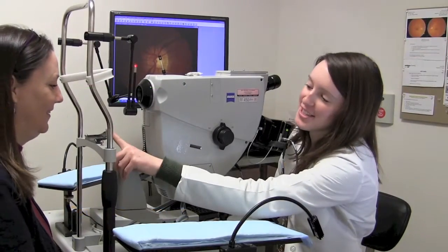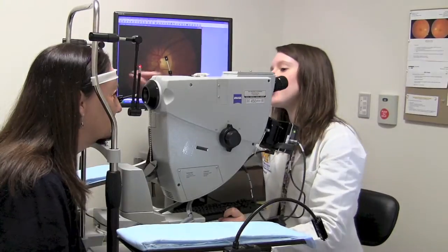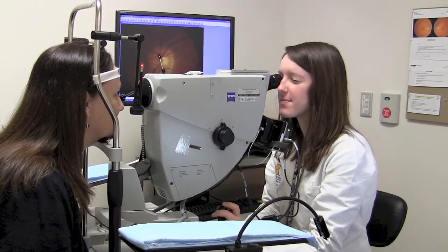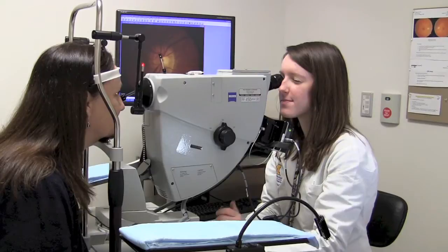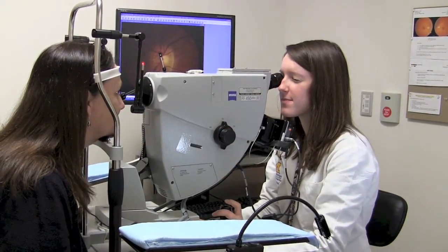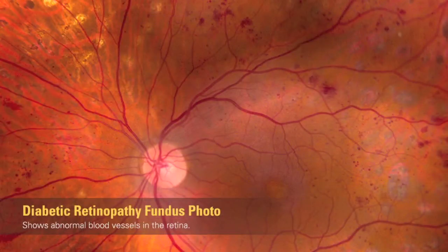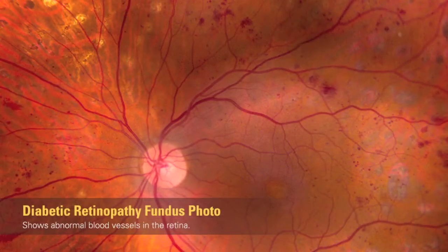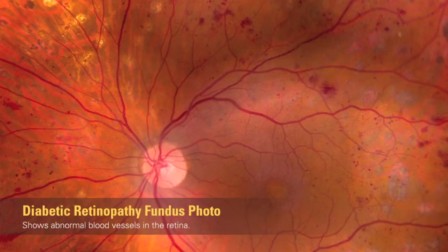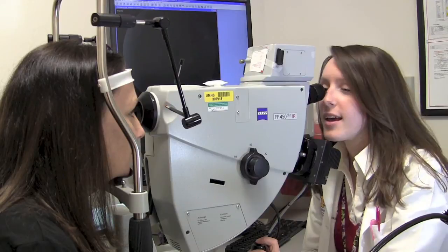A second way to capture the inside of the eye is through fundus photography, which produces detailed pictures of the retina, optic nerve, and macula. These photographs are taken to help your physician monitor your retina over time. For example, in this image, you can see retinal hemorrhages from leaky blood vessels caused by diabetic retinopathy.